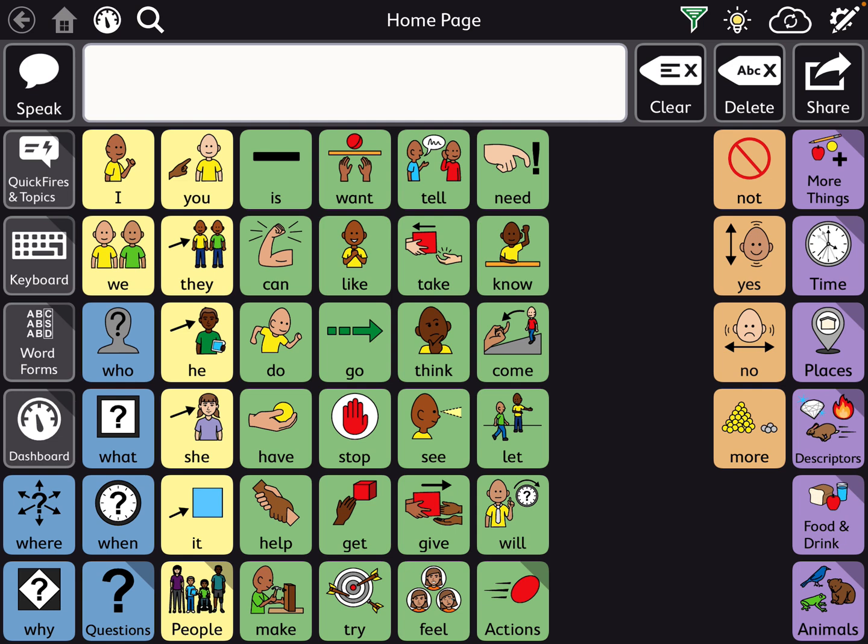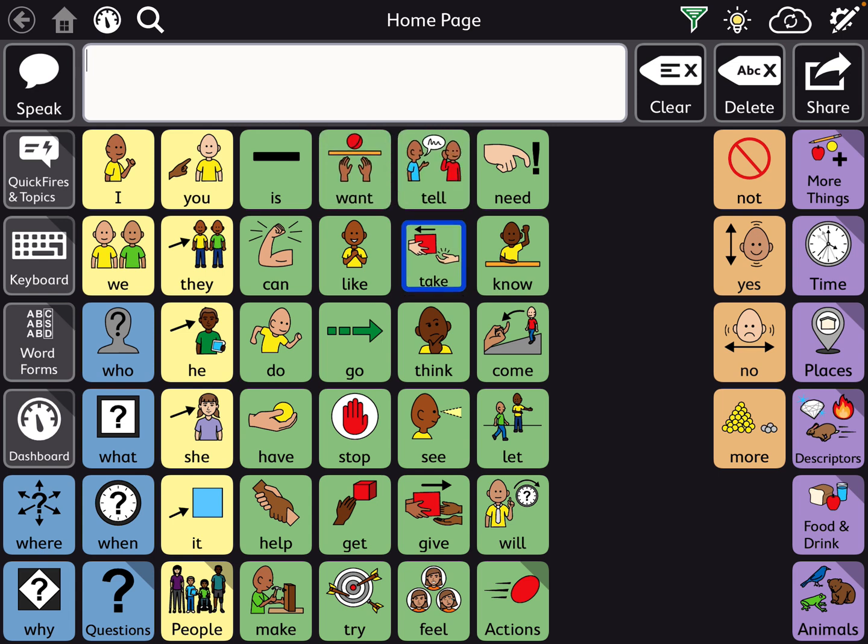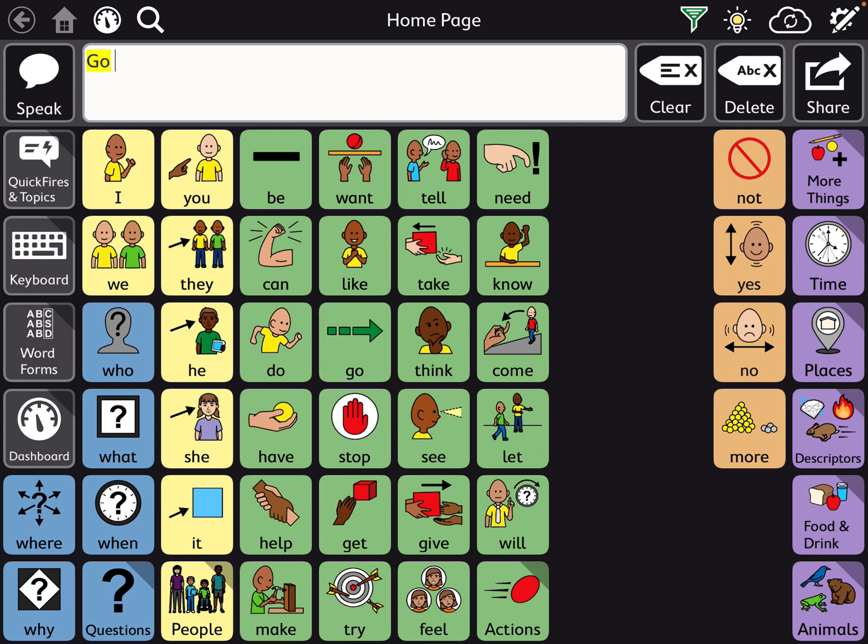what will happen is that I'm going to drag my finger across the screen. And you'll see it's not activating the button, but it's pressing it. And when I'm ready for the one I want, I just rest it for a little longer and then I release it and it will say go.